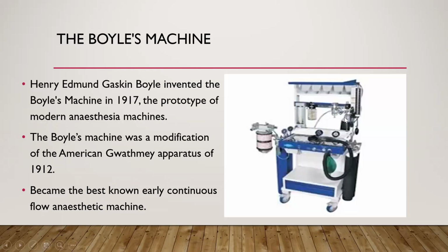You can see the gas cylinders. We have the flow meter bank. We have our glass vaporizer, and the breathing circuit. And this is your carbon dioxide absorber.